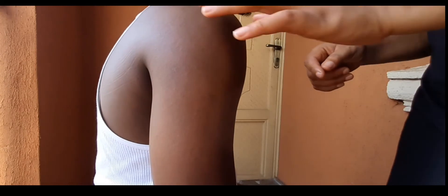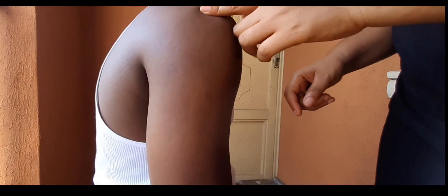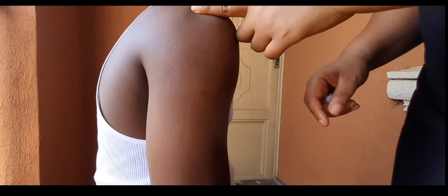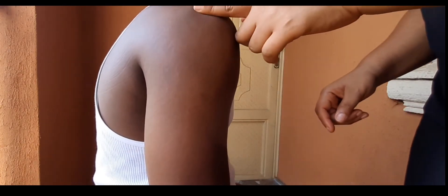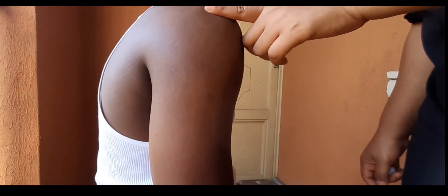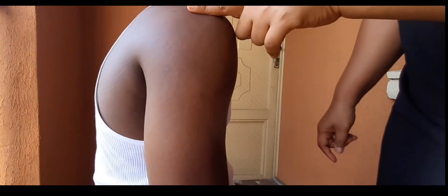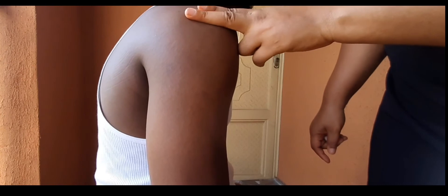The first thing you are going to do is locate the landmark before you give the injection, so that you can get the right site. On the shoulder there is a bony prominence known as the acromion process — that is the place I am touching. Once you locate the acromion process, you place one of your fingers there, then you place a second finger below the first finger.